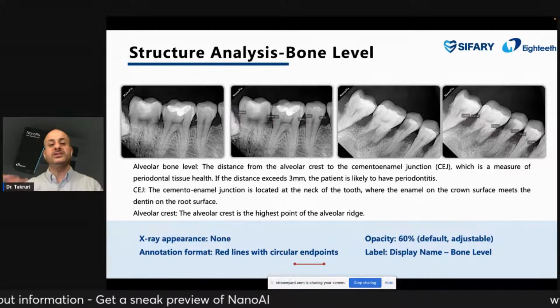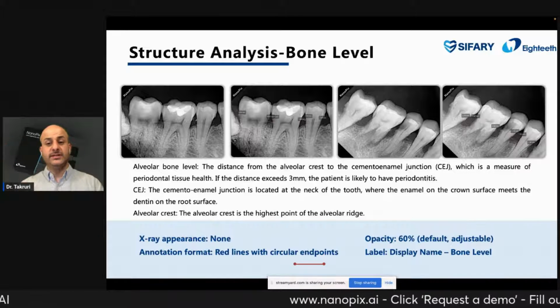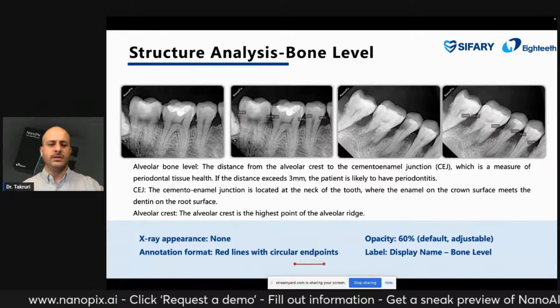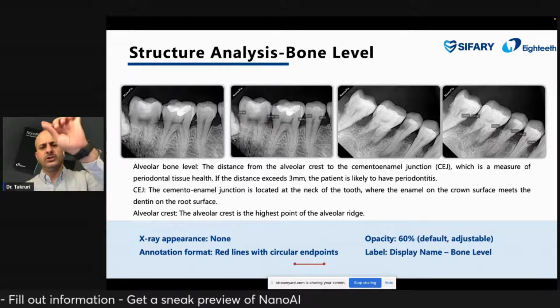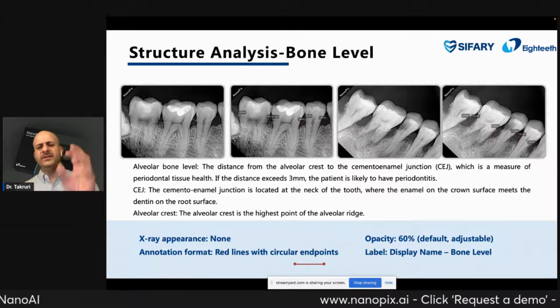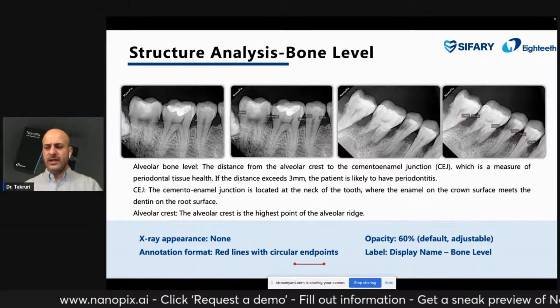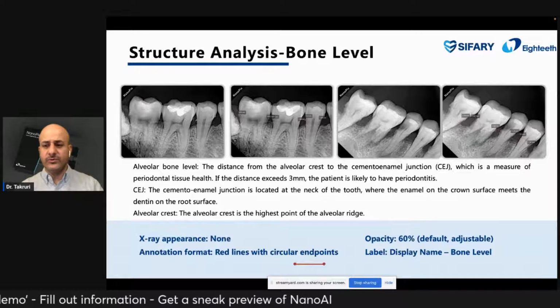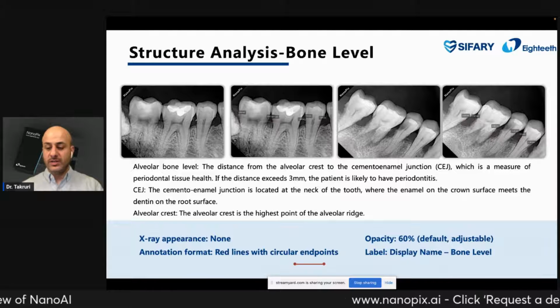So when you are giving your patient this report, without going to Keynote or any other program to write and put comments, or drawing lines on the sensor itself using a ruler and then printing a report by hand, no, you just press one button, and you can transfer it to the patient's iPhone or smartphone, and your patient can take it and show it to the referral doctor.